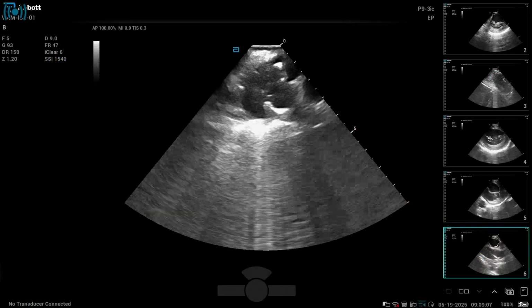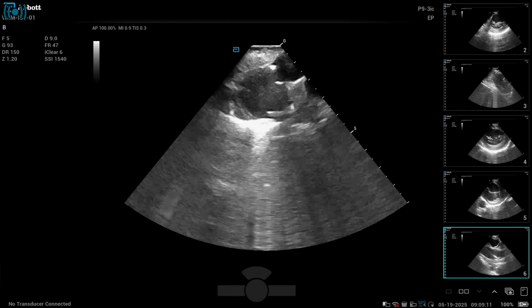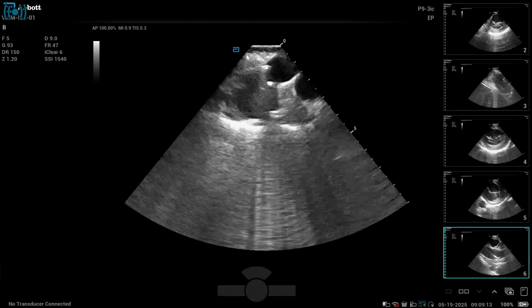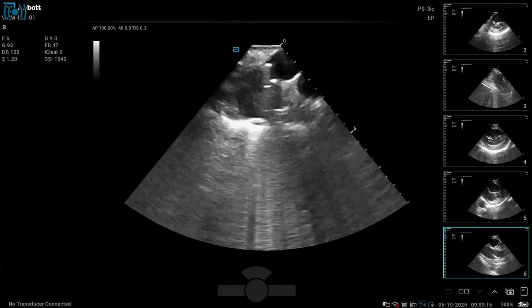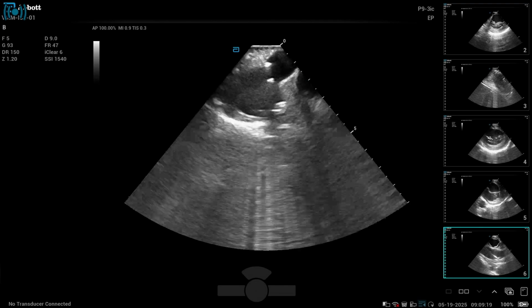Okay, we can go. I always ask for echo guidance. I say, I have this luxury, I have to take the maximum advantage. I can move to Italy. You have a good wine here.